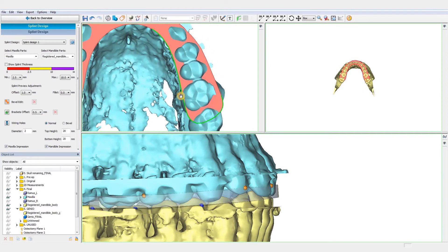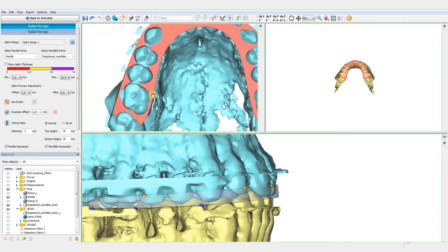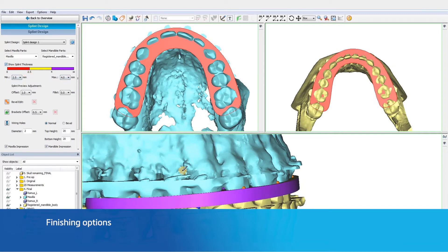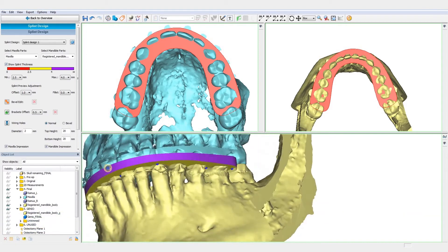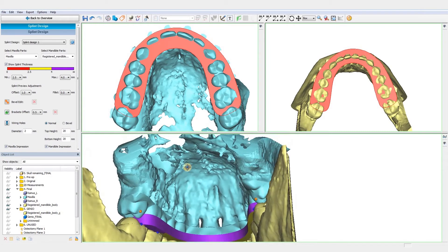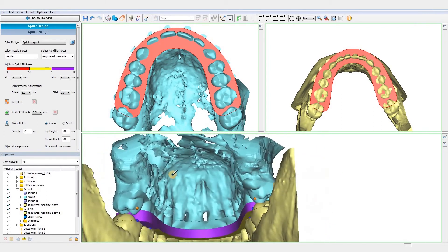Finally, we can also increase the whole size of the splint with the offset tool. When we are happy with our splint design, multiple finishing options are available. We can analyze the splint thickness by toggling this box and check if it is in a reasonable range. Take into account that very thin regions might not print.